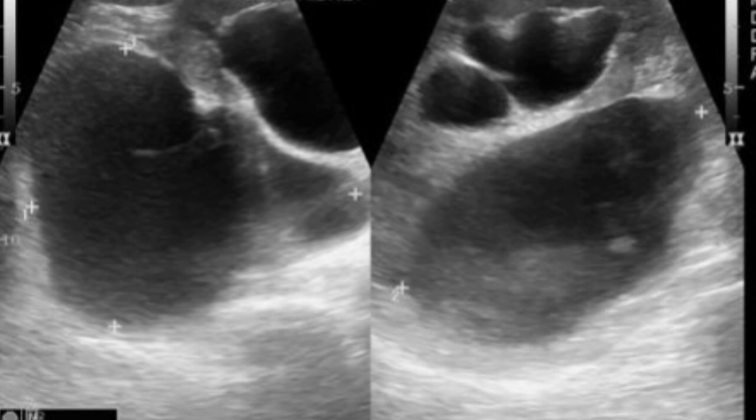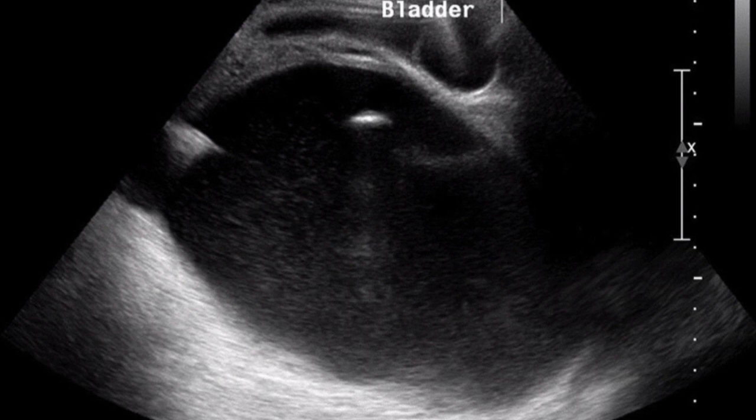And this is an example of urinoma. You can see already there is severe hydronephrosis, and urinoma is formed outside because of the leakage. Then urinoma around the pelvic area, and the bladder is pushed upwards.